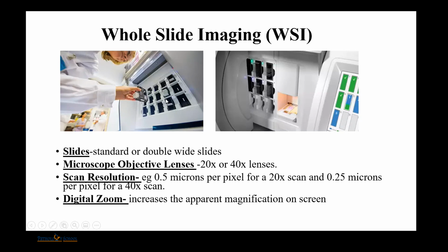So before loading in your slides, some hospitals have their own SOPs as to how the slides should be. Some of them prefer that the slide sections are taken very thin to get a beautiful image. Second, it should be a 15 by 15 of tissue on the slide. The slides should be dry. There should be no oil or marker on the cover slip.